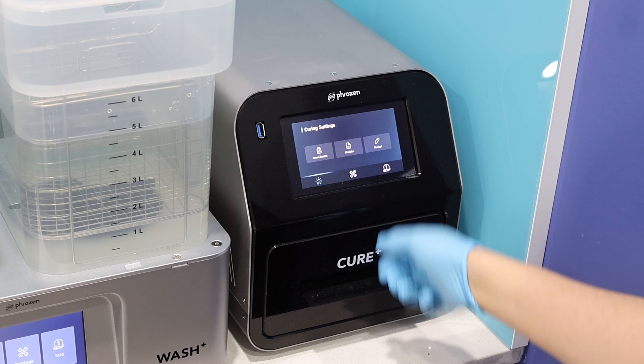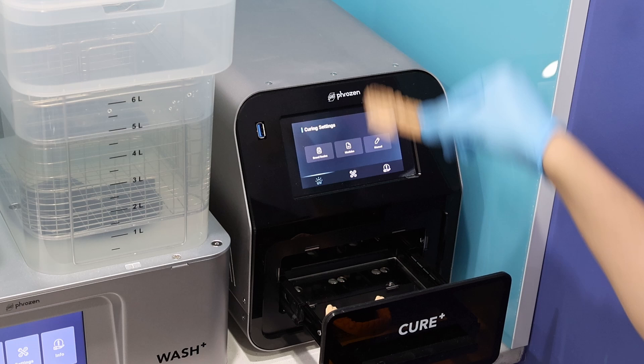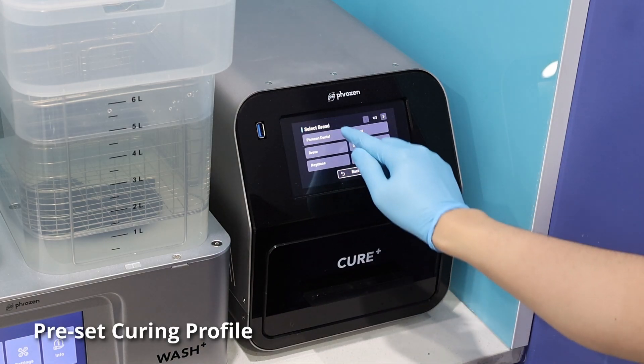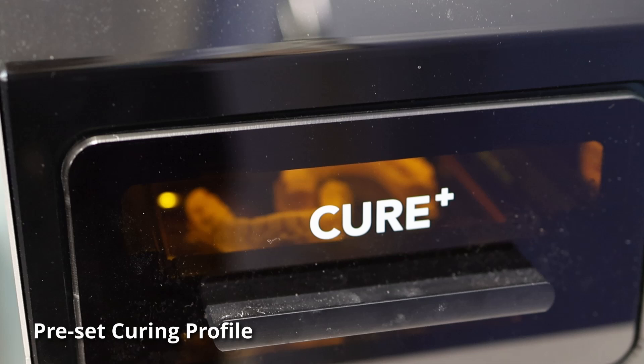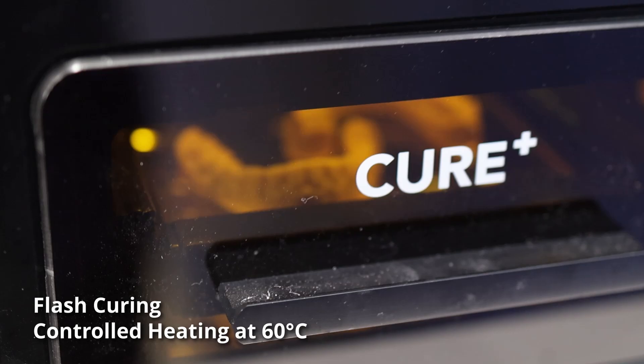I'm also really impressed with the Cure Plus. I think it's really nice and compact — it looks good and performs quite quietly, so you can use it in a dental office while patients are around. There is a growing list of resins being validated for this curing unit. I'm really quite happy with how this curing unit performed — it's just a nice general curing unit for dental resins.